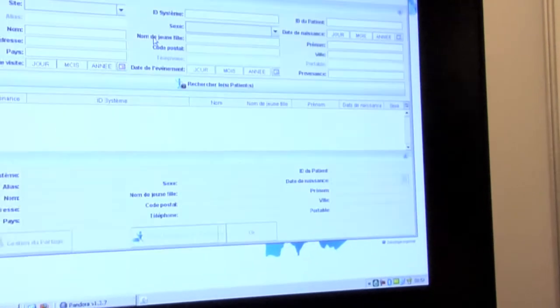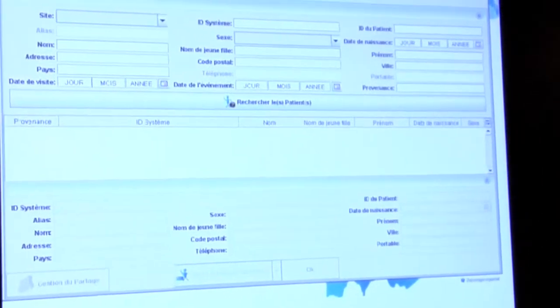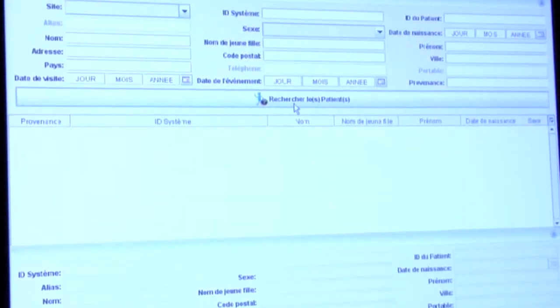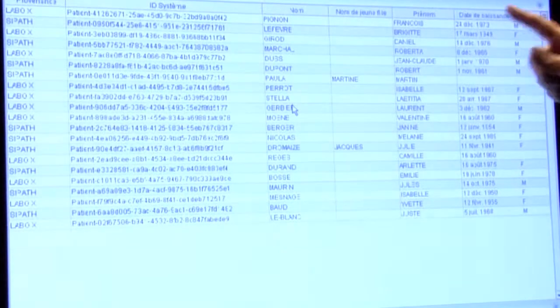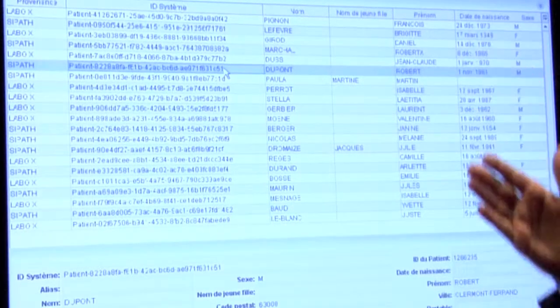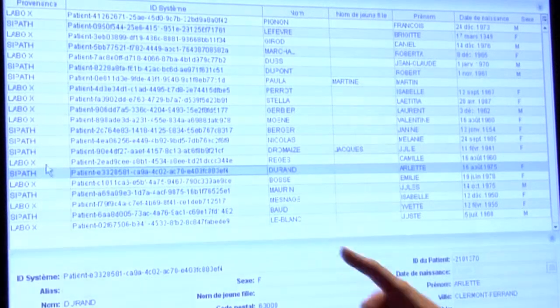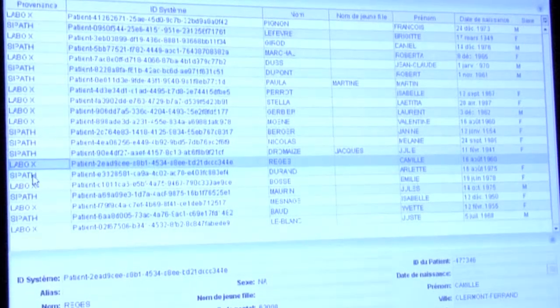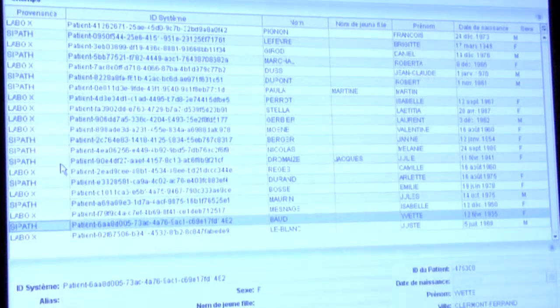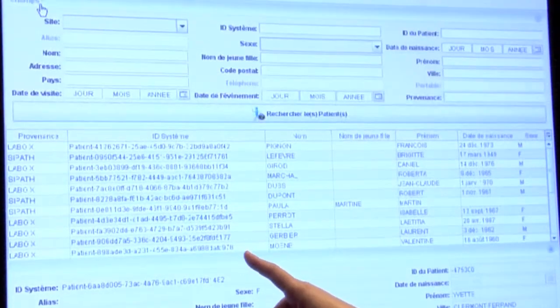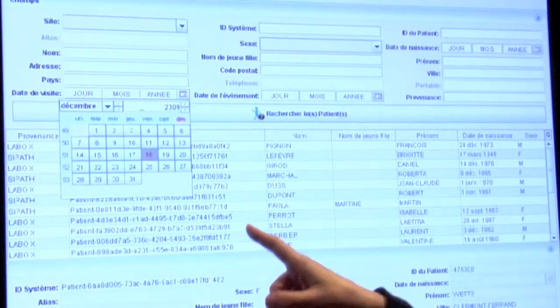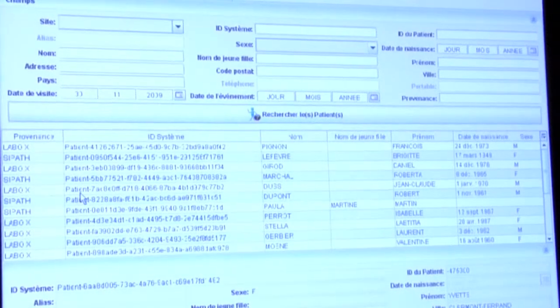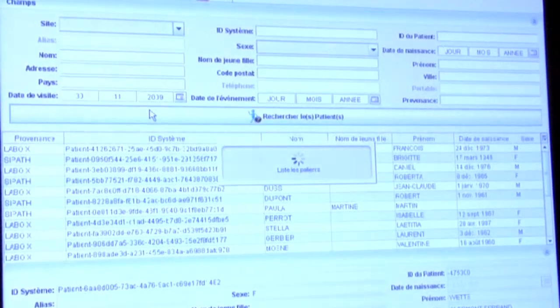So we are logged on the platform and we can have different fields there to search the patient. This is the list of the patients that are hosted in the different laboratories, Labo X and SIPATH laboratory, and you can see that each patient sheet can be recognized using a random number associated to each patient.